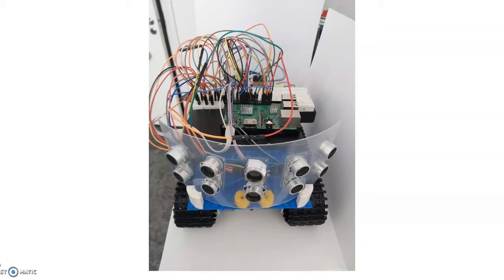Self-Learning Scale Prototype of a Wheelchair Base to Facilitate Mobility for People with Physical Limitations. In this video, I will guide you through an explanation of the final design of the prototype, an explanation of the code implemented for the learning algorithm, and a series of test and learning sessions where the device was placed in a closed environment. In the end, a final test presenting the results and the learning of the prototype behavior will be presented.